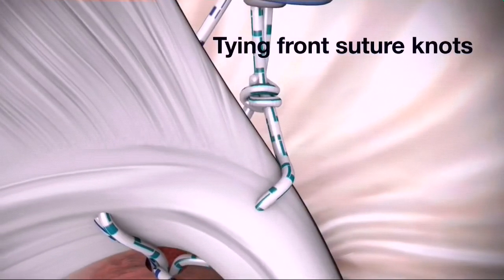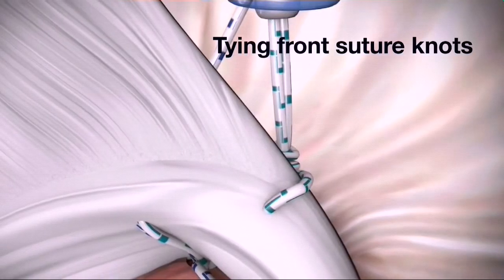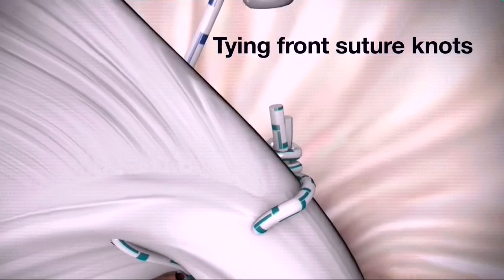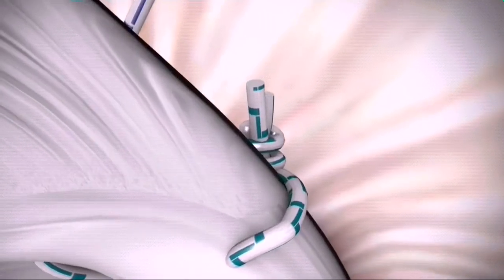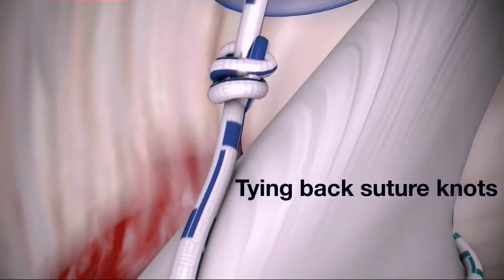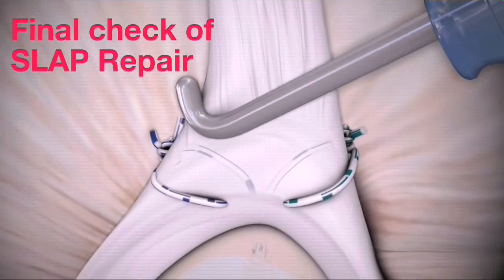Complete the anterior portion of the repair by tying the arthroscopic knot and cutting the excess suture with the katana suture cutter. Be sure to keep the post and knot away from the articular surface. Repeat these steps for the posterior mattress stitch and probe the completed repair.